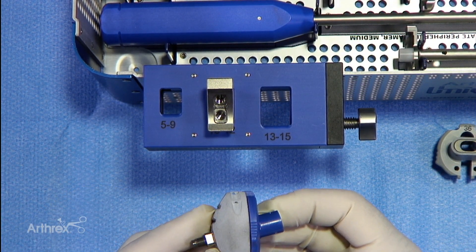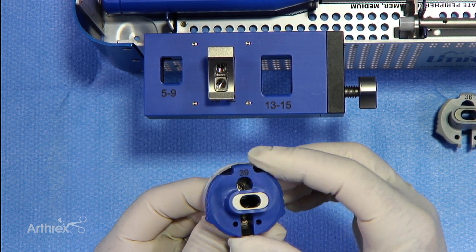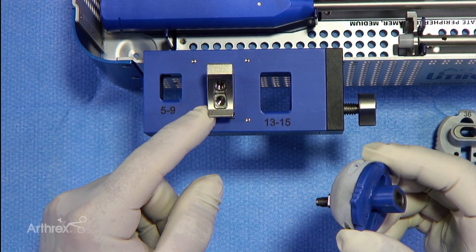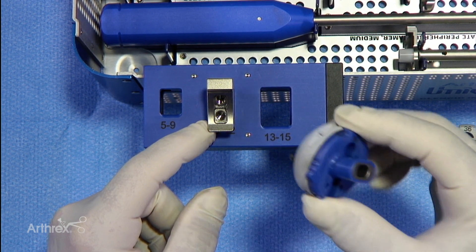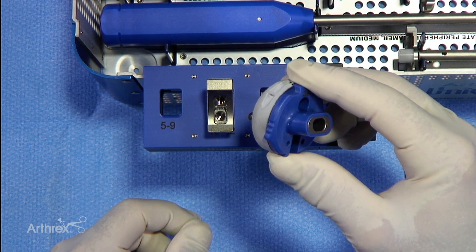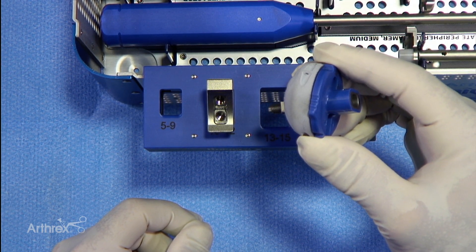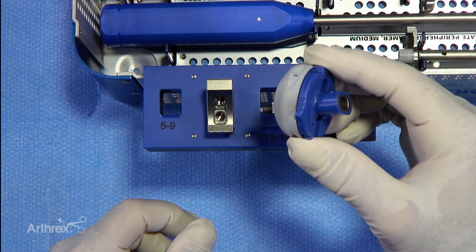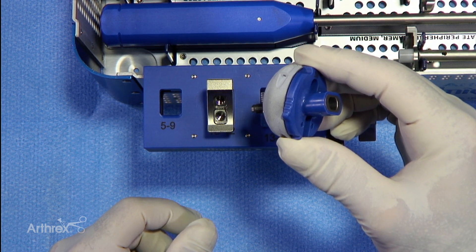We'll then take our cup, which has our guide already inserted, and place that in the proper position with regards to the stem. This stem will allow the implant cup inclination to vary between 135 and 155 degrees. The most commonly used alignment is the 135, and therefore we'll demonstrate the way to properly fix the cup in the position of a 135.